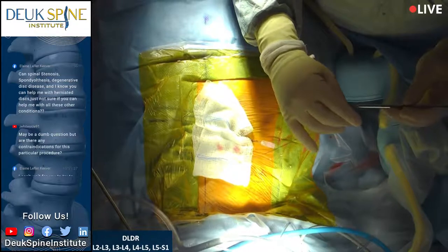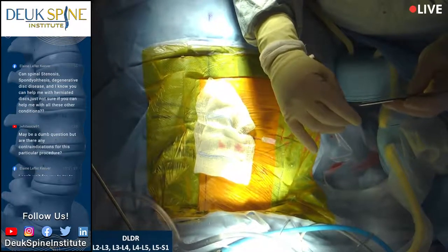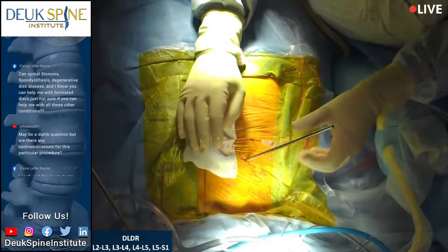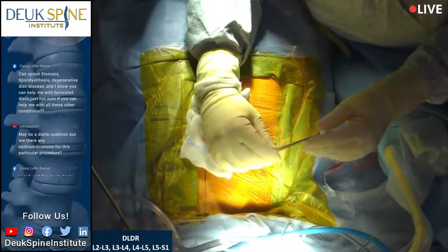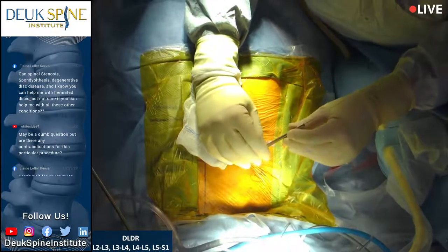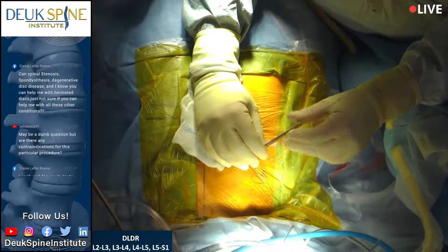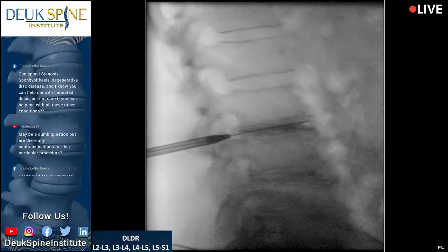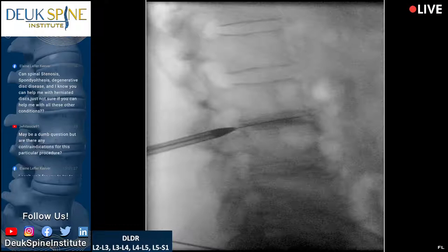Yeah. So, great question. Would you still do surgery if there was no back pain or leg pain, but they had lots of numbness and weakness? The answer is yes. Numbness and weakness usually mean there's a pinched nerve. And we would do this surgery to unpinch the nerve. That's what we're doing the surgery for. This particular patient has back pain and he has weakness and numbness in his legs. So we're doing it for the inflammatory reasons, but also for the radiculopathy. Lay still, you're doing great. You want me to wait?